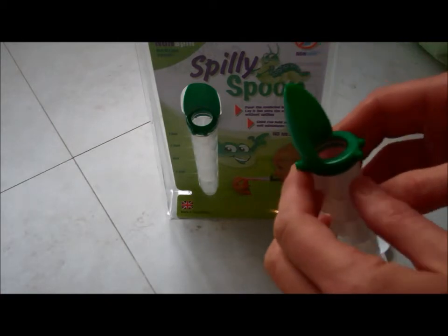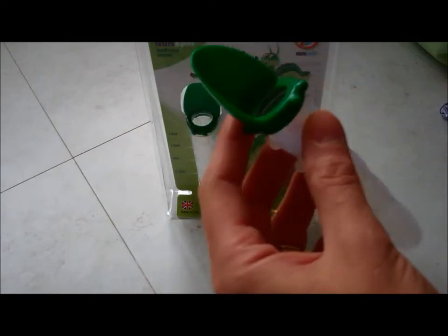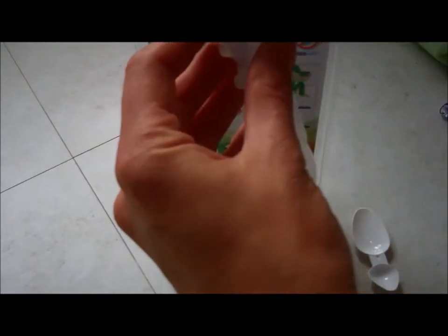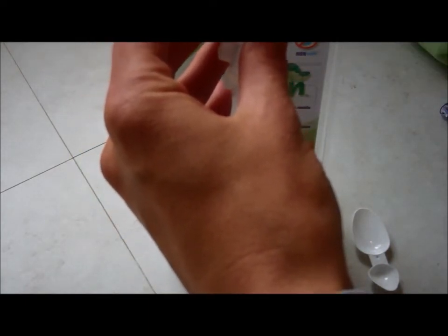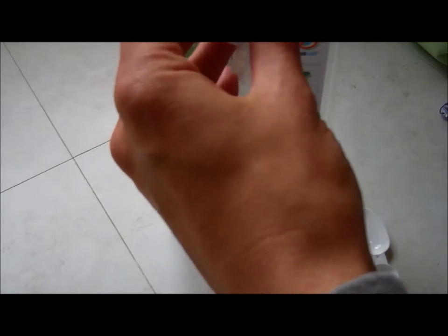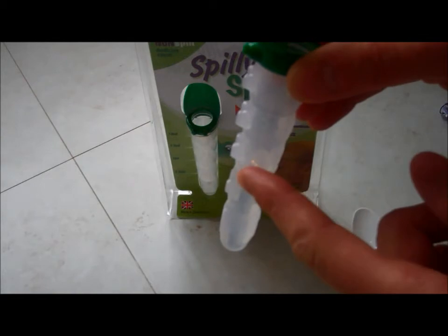All you need to do is just fill it up. Look at what medicine you need to give them and the amount, and just pop that inside. It's very easy to see the measurements because the Spilly Spoon is measured — it looks a bit like a caterpillar, so it's all in sort of body sections.